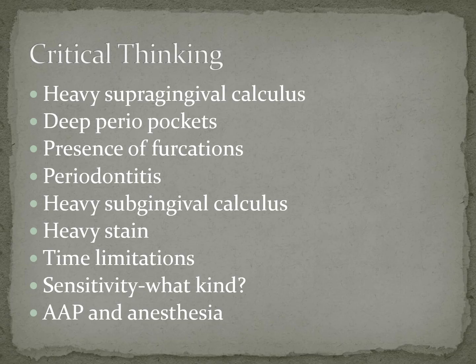Now, some critical thinking. Why are we going to use this? We're going to use this if a patient has some heavy supragingival calculus, and we may use the beaver tail for that. Okay. Maybe my patient then also has some deep perio pockets. Well, then I might need my slim line to get deeper down in the pocket for that. But I'd have to turn my power down a little bit. So maybe I want higher power for my supragingival calculus.